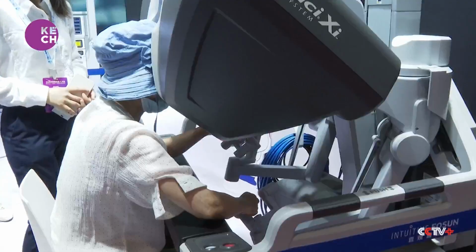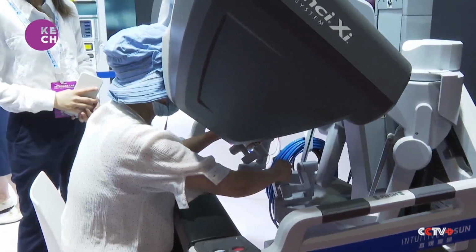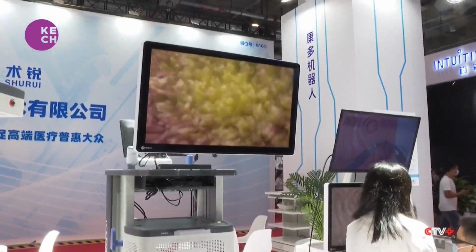But the high cost of medical robots has always been a great concern worldwide, and Chinese manufacturers are working on domestic medical robots to make them more affordable and innovative. Besides relatively pricier devices that integrate more complex technologies, we are also developing affordable and simple rehab robots that can ensure their movement is repeated in exactly the same way each time and enable the muscle to move.